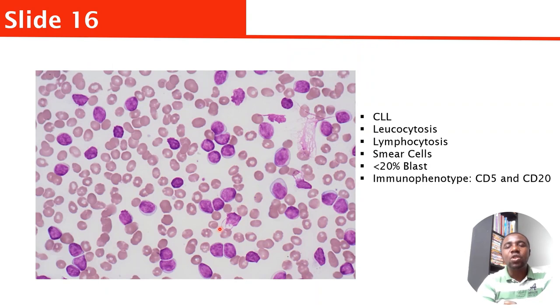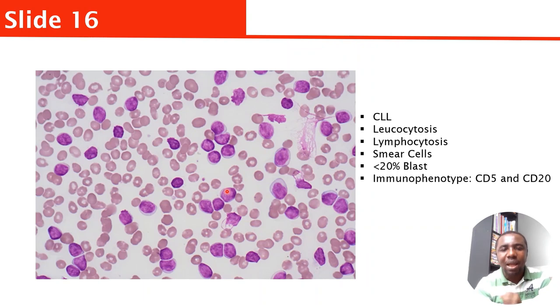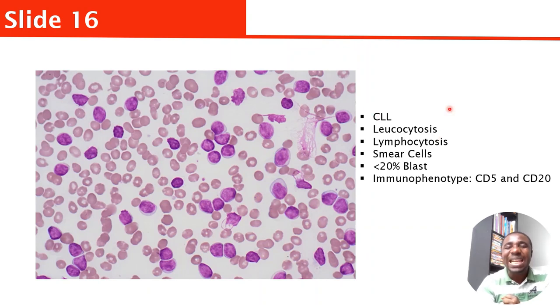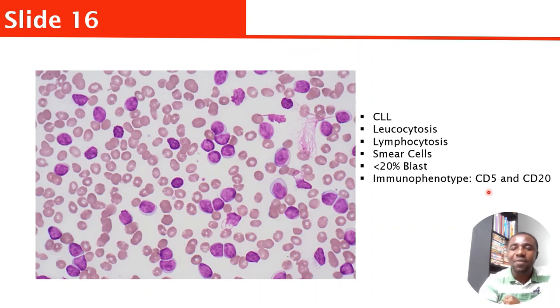This is chronic lymphocytic leukemia, CLL. You can see a lot of mature lymphocytes and a high cell count — think about chronic lymphocytic leukemia. The giveaway here is smear cells. Once you see smear cells, that's the giveaway. You do immunophenotyping to confirm it. With CLL, they commonly express CD5 and CD20.